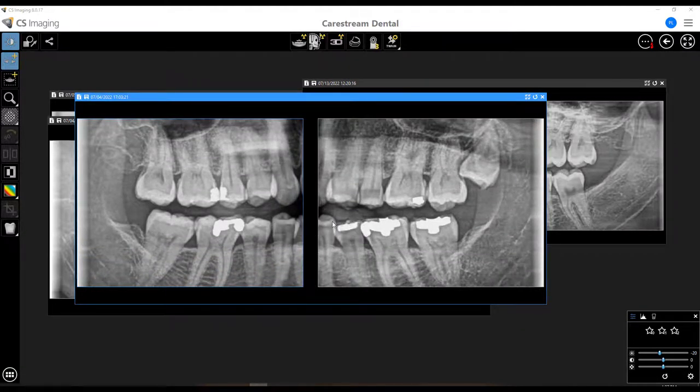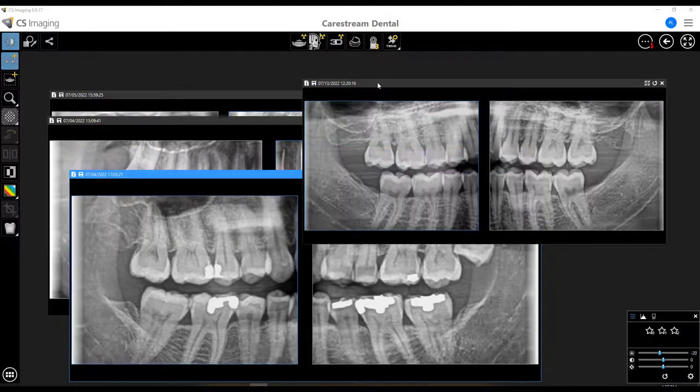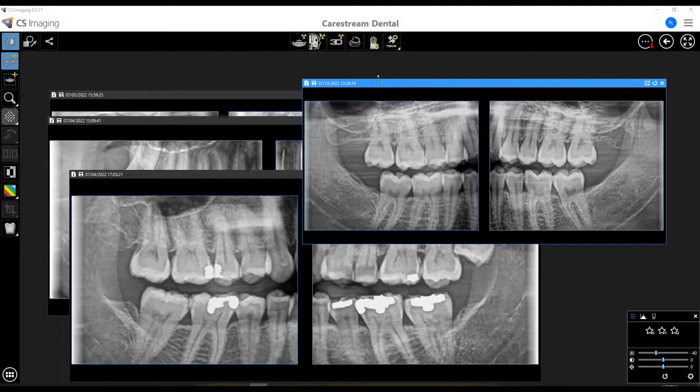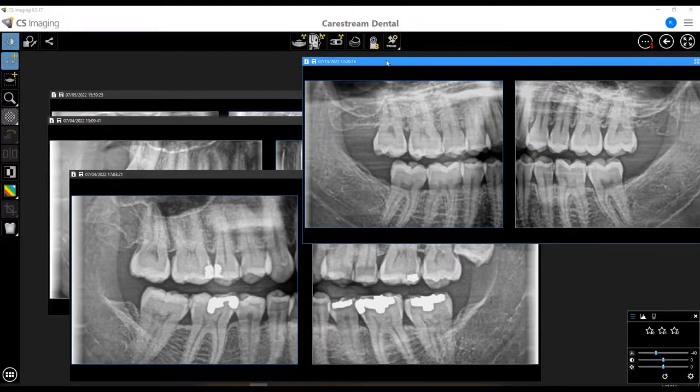Here's one example, and here's another example of a bitewing that I captured recently.